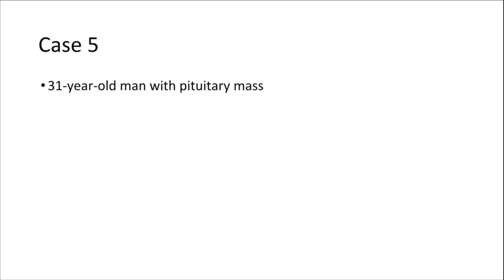Okay, the next one is case 5, another straightforward history, a 31-year-old man with a pituitary mass. That's what we had at the time we received the specimen as a consult.